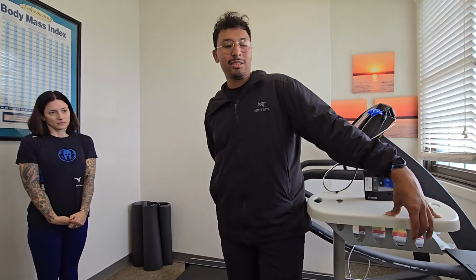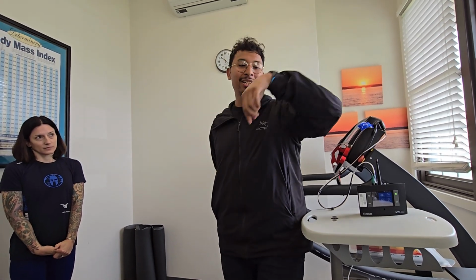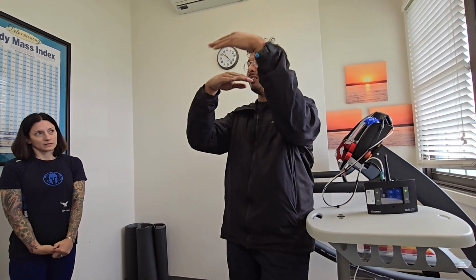Whenever she's breathing and she's getting a sample through that sampling line going into the K5, those samples go into what's called a mixing chamber. Basically, the breaths will mix, and then you get one data point after 30 seconds. That first data point at 30 seconds then gets updated every 10 seconds, but those next 10 seconds are an average of the previous 30 seconds. So it's like they're compiling on top of each other.